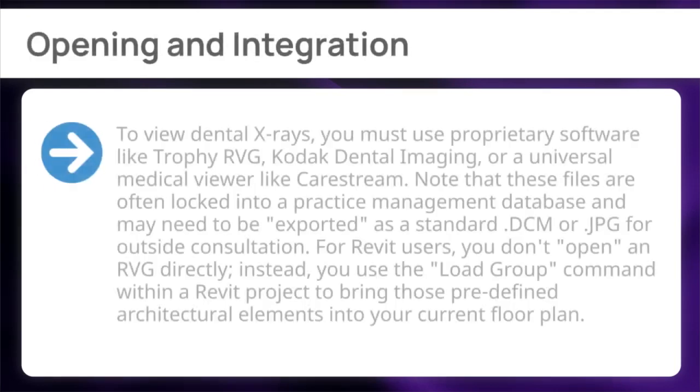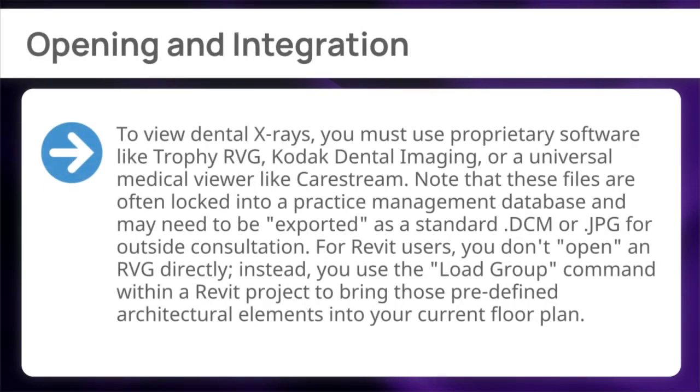Next, opening and integration. To view dental x-rays, you must use proprietary software like Trophy RVG, Kodak Dental Imaging, or a universal medical viewer like Carestream. Note that these files are often locked into a practice management database and may need to be exported as a standard .dcm or JPG for outside consultation.